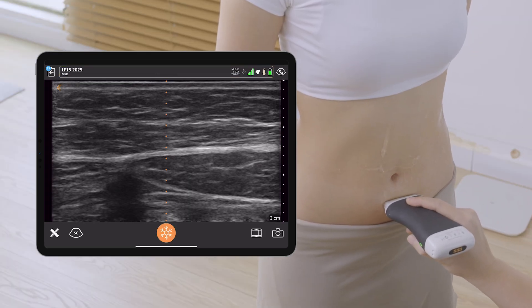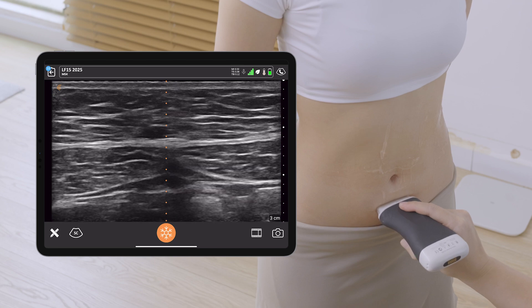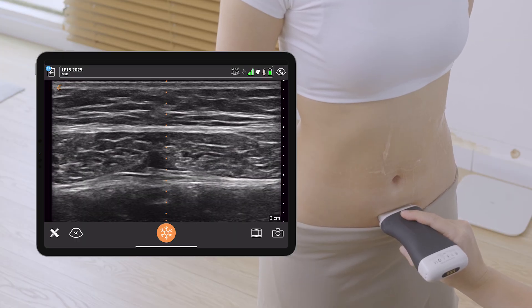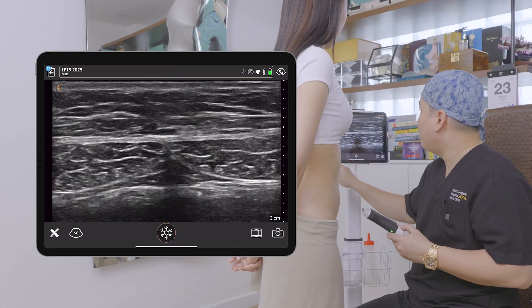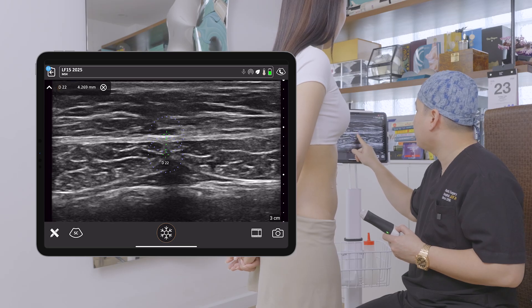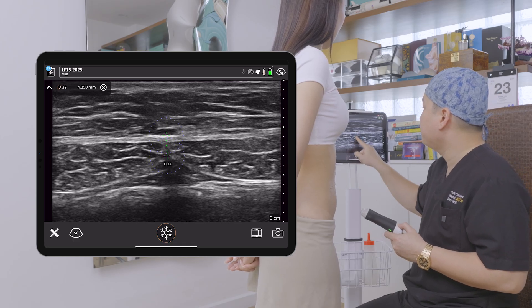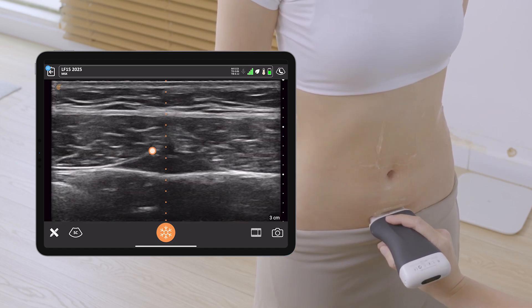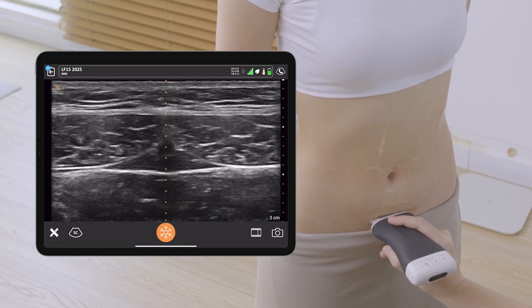We can go down into the lower abdomen. You can see the linea alba is even thicker for her. In normal patients, the average thickness in the lower abdomen is between 1.9mm to about 2.4mm, but this patient is more than that. Her linea alba in the midline is very, very thick — almost 5mm. When you scan all the way down near her pubic bone, you can actually see a muscle called the pyramidalis, a very small muscle group at the very end of the linea alba.